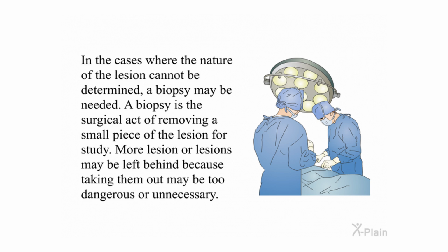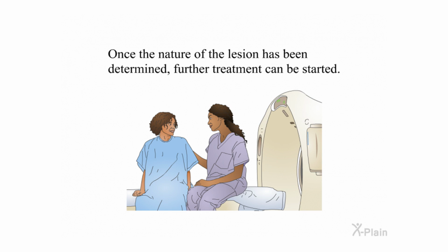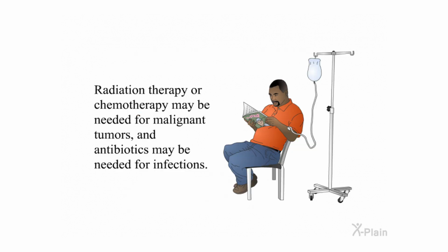In the cases where the nature of the lesion cannot be determined, a biopsy may be needed. A biopsy is a surgical act of removing a small piece of the lesion for study. More of the lesion or lesions may be left behind because taking them out may be too dangerous or unnecessary. Once the nature of the lesion has been determined, further treatment can be started. Radiation therapy or chemotherapy may be needed for malignant tumors, and antibiotics may be needed for infections.